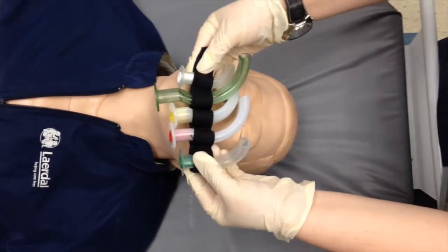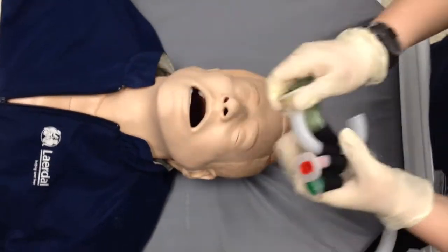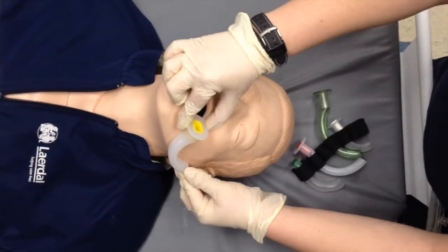Select a correct size airway by comparing the curved length of the airway to the distance from the corner of the mouth to the angle of the jaw.